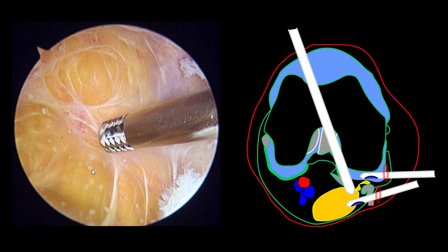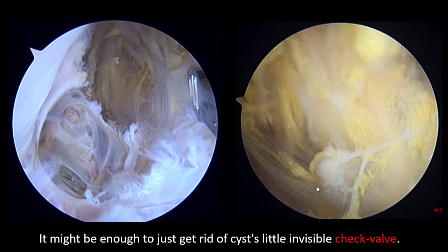This is the intra-cystic view. You can see multiple septa over there. It might be enough to just get rid of cyst's little invisible check valve. Thank you.